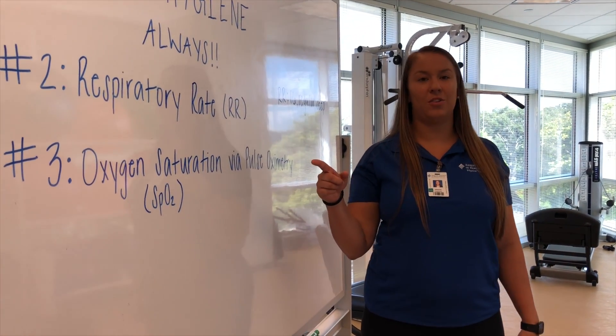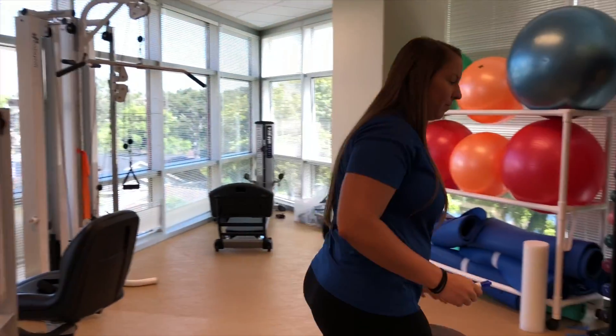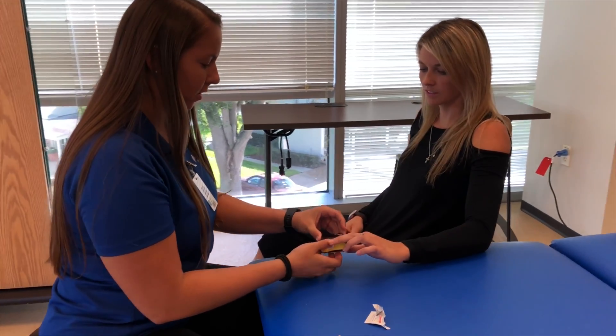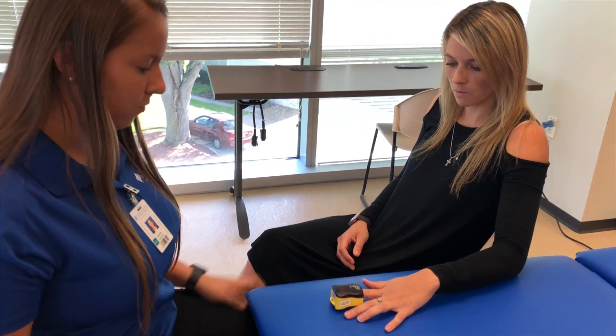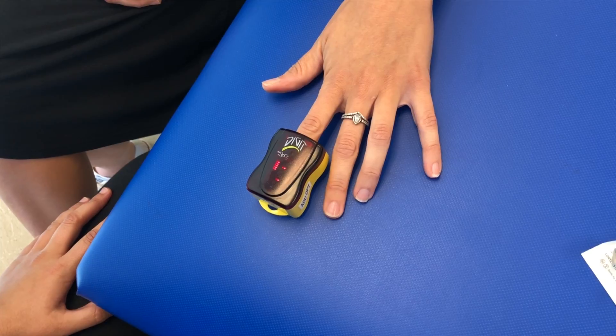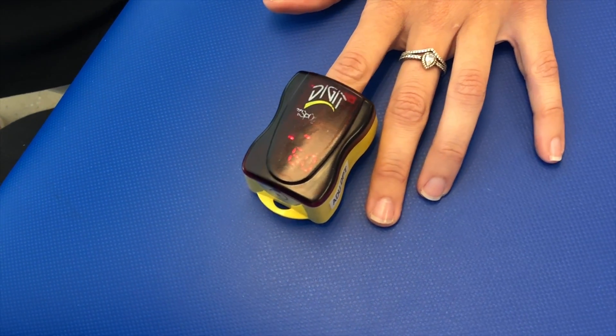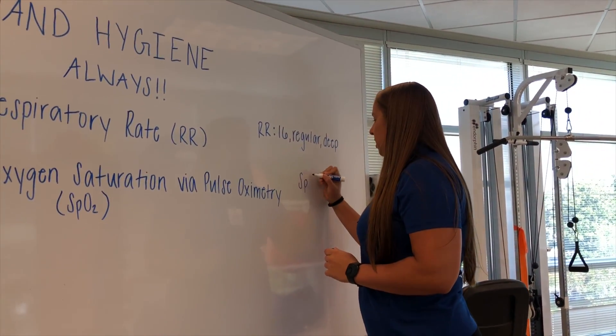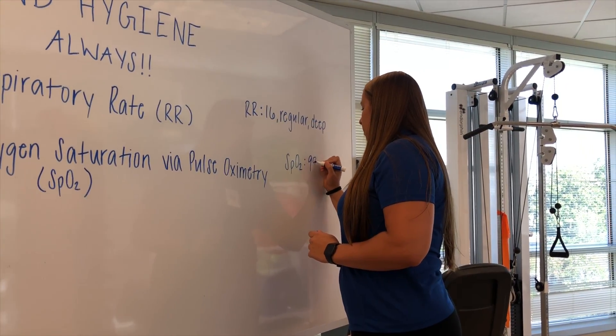Next we're going to do oxygen saturation via pulse oximetry. Going back to the patient — hi Courtney. So we're going to clean our device first. Courtney, I'm going to have you stick your finger all the way inside until you feel the very back, then have your hand flat on the table. Let's place that finger right there — feel the back? Alright, flat hand. I'm going to press the on button and we're going to wait for our reading. You can go ahead and take that finger off. SpO2: 98%.